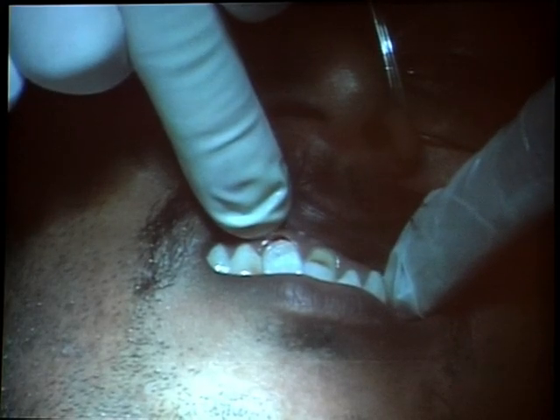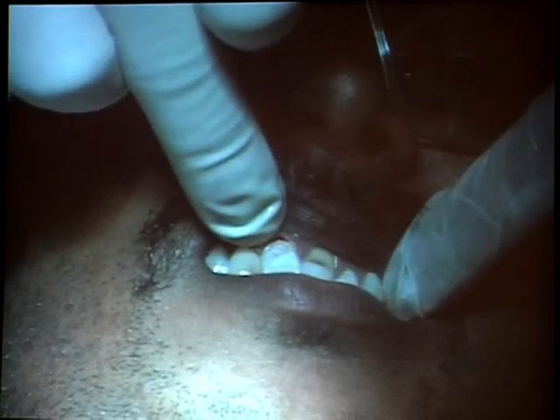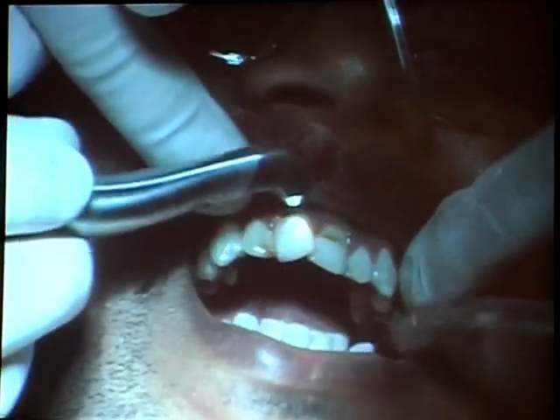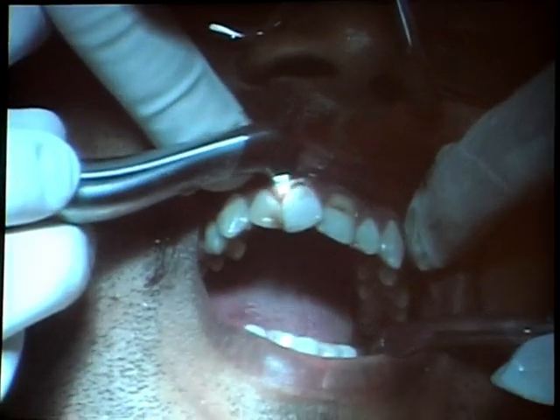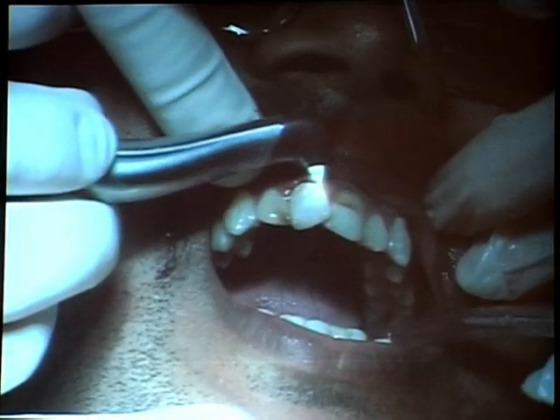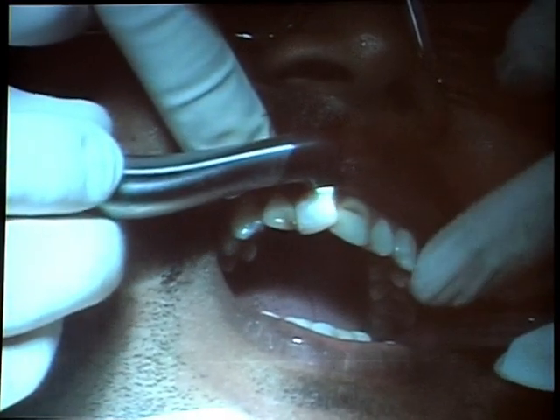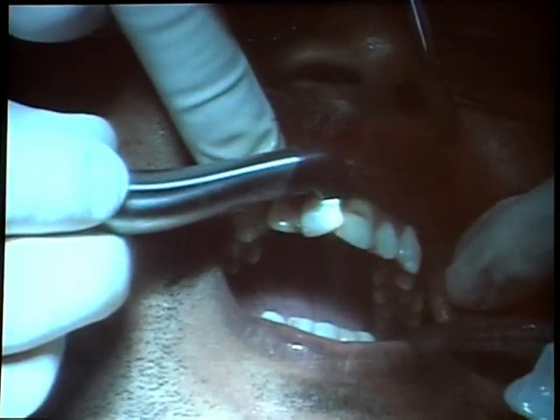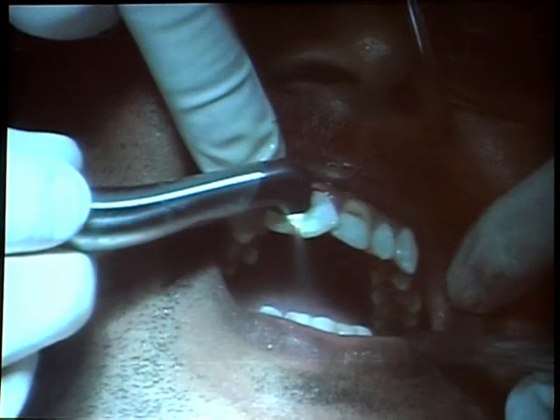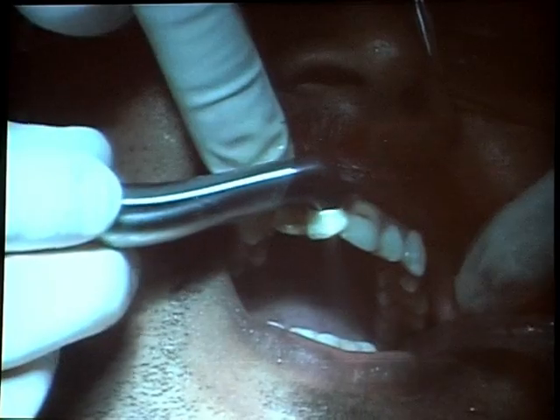The other issue about absorption in dentine is caries dentine. What happens in caries dentine? There is more water content because the inorganic content comes down and the organic content goes up. And the absorption of this wavelength is basically highest in water. So it gets absorbed in water, the water expands, it actually expels out the hydroxyapatite crystal and it's called an explosive expansion. That's the mechanism of action.